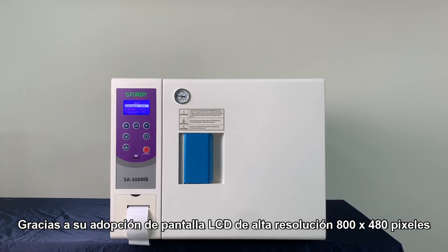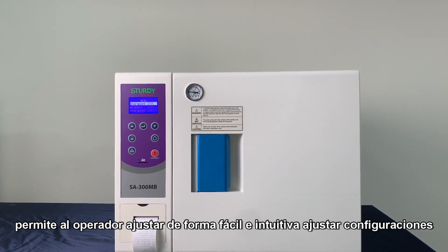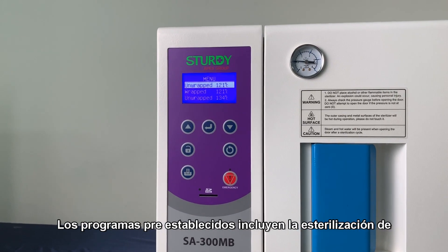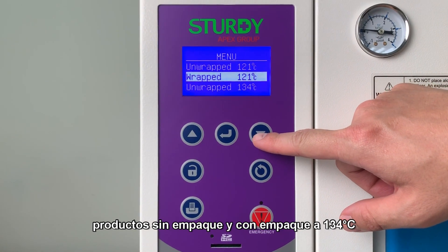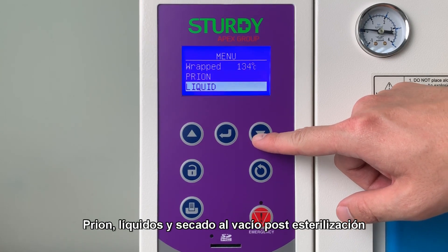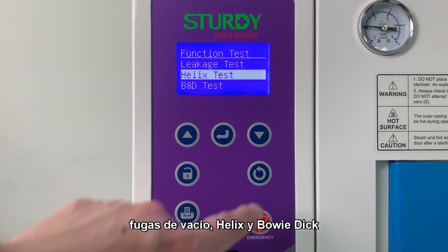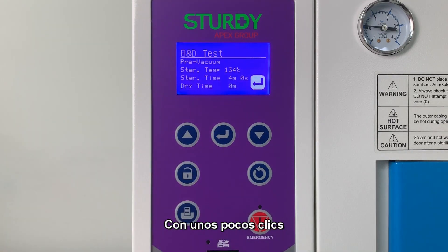Let us take a look at the control panel. Thanks to its high-resolution 800 by 480 pixel LCD display, the operator can easily and intuitively adjust settings and initiate pre-established programs with just a few clicks. Pre-established programs include sterilization of unwrapped and wrapped products at 121°C, unwrapped and wrapped products at 134°C, prion, liquid, post-sterilization vacuum drying, and performance assurance testing including vacuum leakage, Helix, and Bowie-Dick tests.